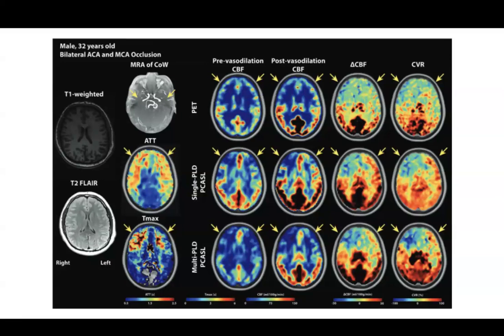Once it dilates, it can give more blood, and some of it will be restored up to the area where it started. But even here, for example, the right corner region, after acetazolamide, you can see there is no perfusion. That means there is no flow happening there. The maximum dilation is happening, and further dilation is not possible. That is the area which is maximum.